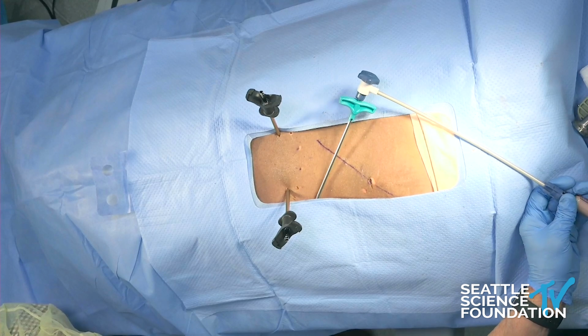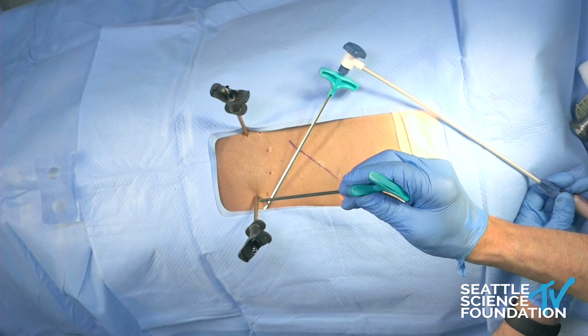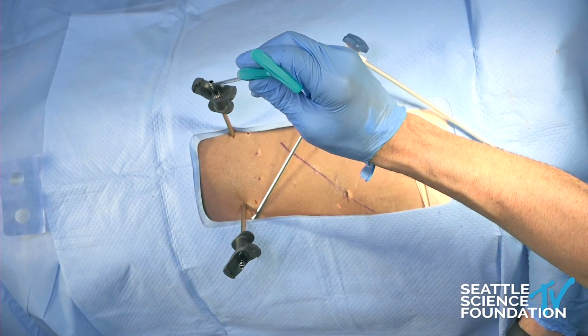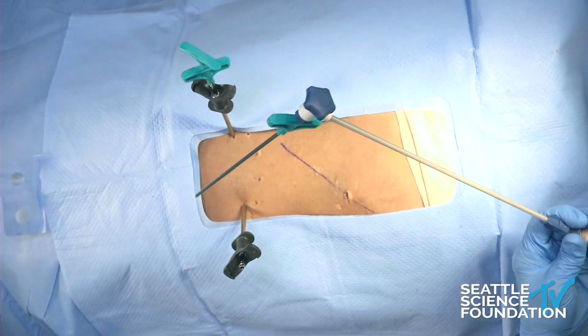Do you have another cannula? Perfect. So we're going to inject on one side then the other. So we're going to put, as a blocker, this one in here to block it, and we're going to inject. We're going to inject on this side.